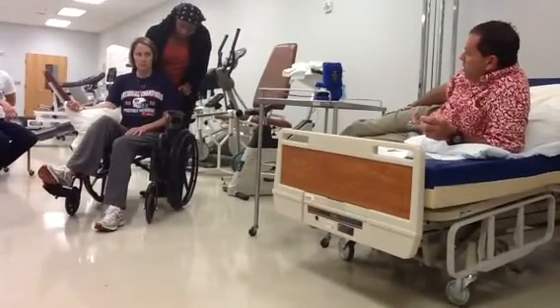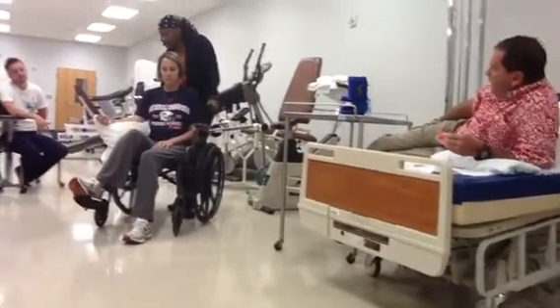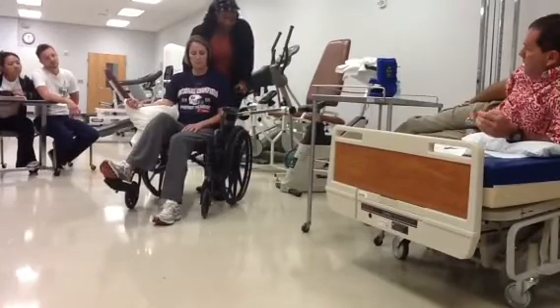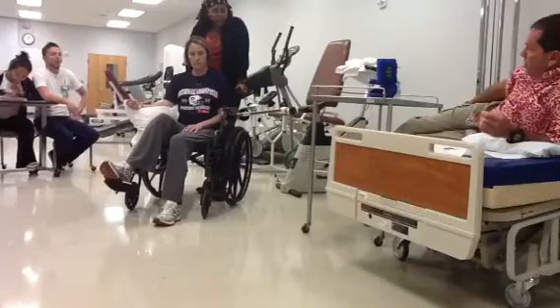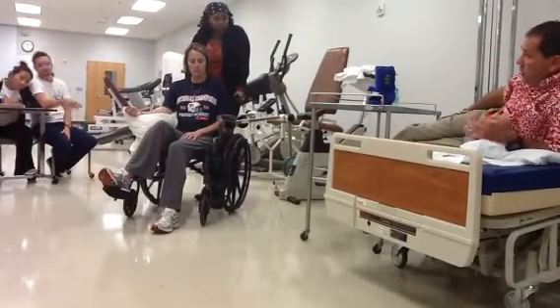The leg rest would obviously be down to where she's maintaining as close to 90 as she can. And make sure that she's sitting up as straight as she possibly can so that she is in a better weight-bearing position. Okay. So we want her sitting up as tall as she can sit up in a good posture.